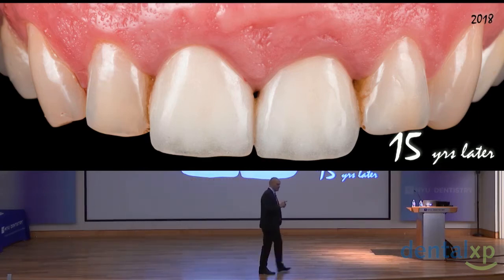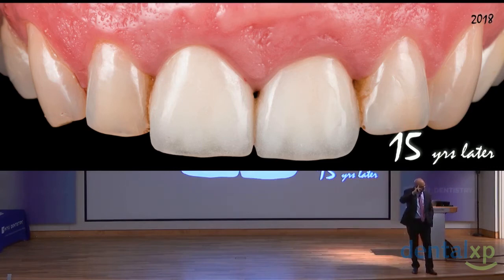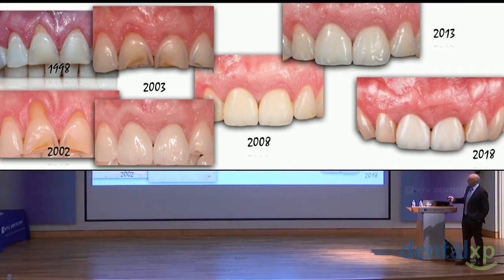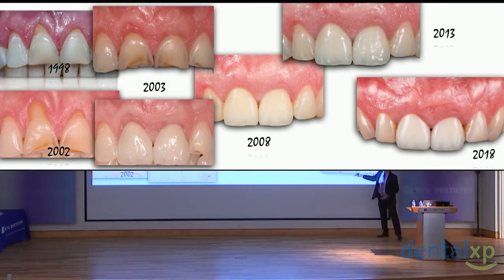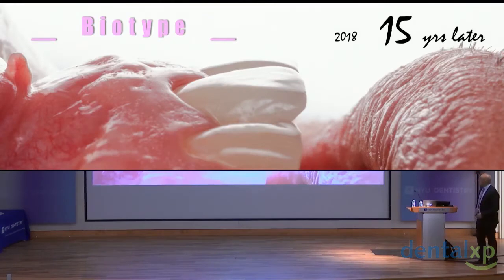So the question is, is that suture really necessary? Maybe, I don't know. 1998, I've been working since 1996. 2002, you understand why I did the soft tissue grafting technique? Because of the trauma the patient was applying to the gingiva. 2003, 2018. Hey, the tooth is almost square. You see? The creeping attachment. And it's a connective tissue graft, not a free gingival graft. Look at the biotype in 2018. Thickness of the gingiva. It wasn't covered at all.